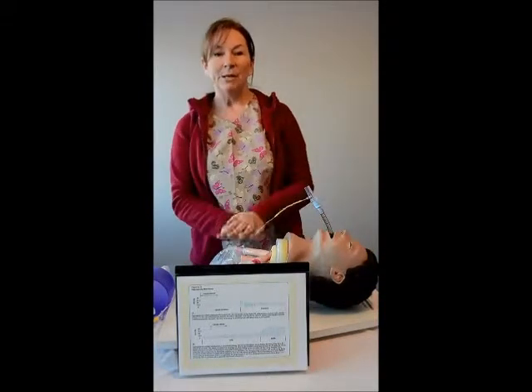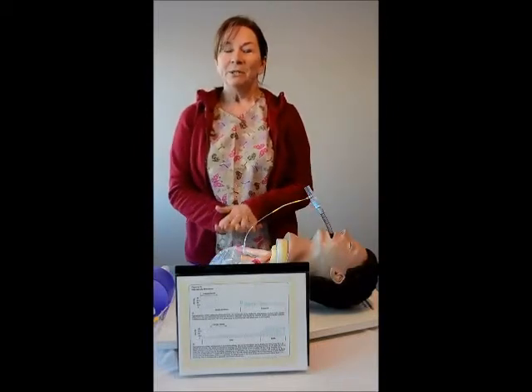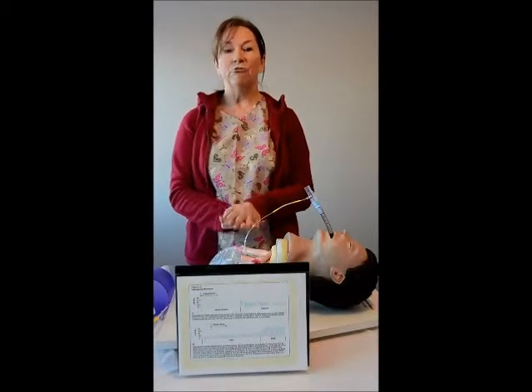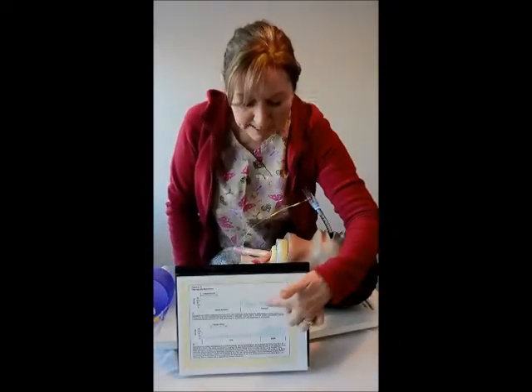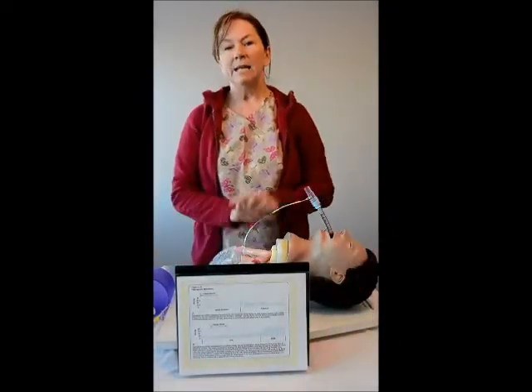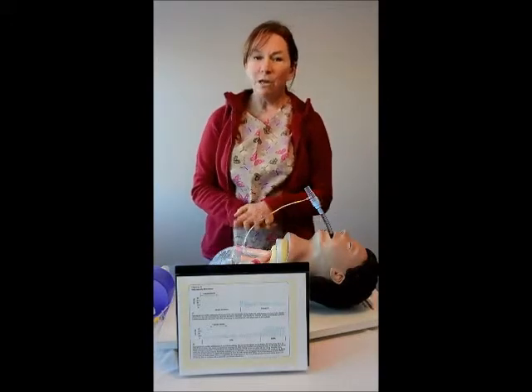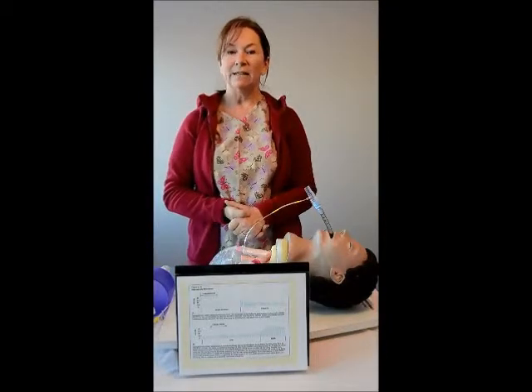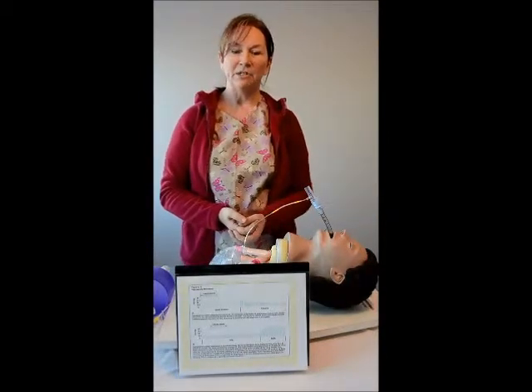So you start CPR. What you will see on your waveform capnography as you are doing compressions is you should have an end-tidal CO2 greater than 10. So you're going to see a waveform analysis here that is above 10. The guidelines recommend that we should be doing CPR for no longer than 2 minutes because we do become ineffective in that compression depth of 2 inches and the rate of at least 100 compressions per minute.